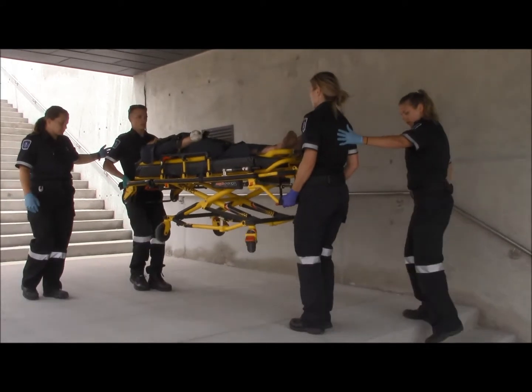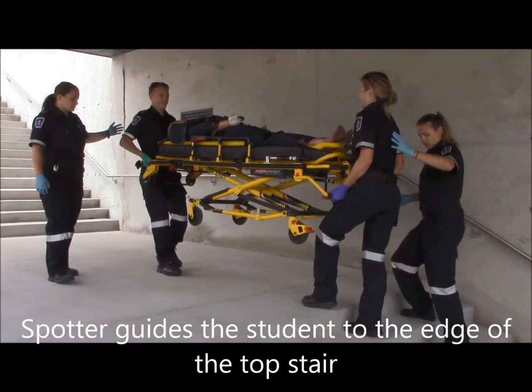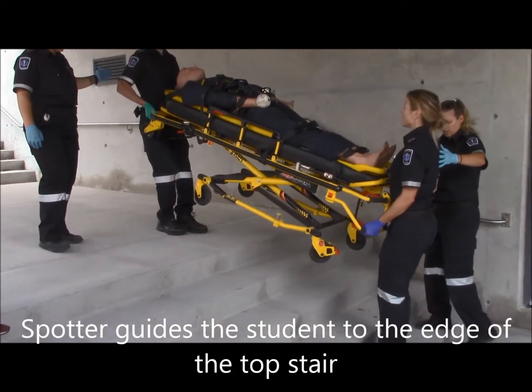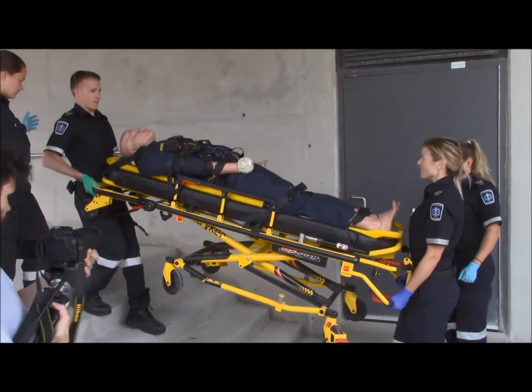The spotter, you'll note here now, is going to back up the person at the foot end to the edge of the stairs. Again, this is for your safety. And then you'll begin the descent. Step, step, etc.